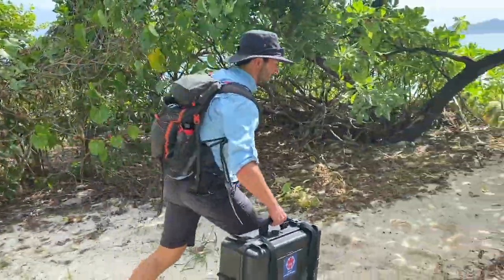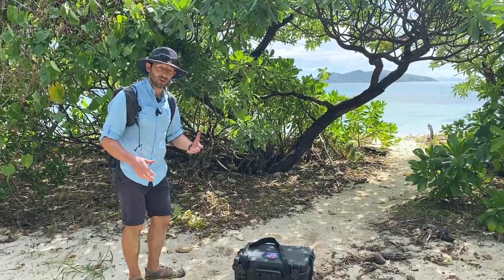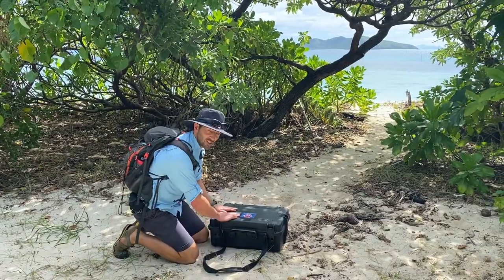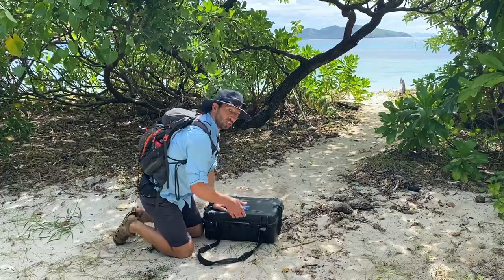So this is what we've got. It's quite heavy — I wouldn't want to trek with this, but luckily most of our transportation is by vehicle. It's all in a sealed Peli case so it's waterproof, because we're doing a lot of water stuff as well.